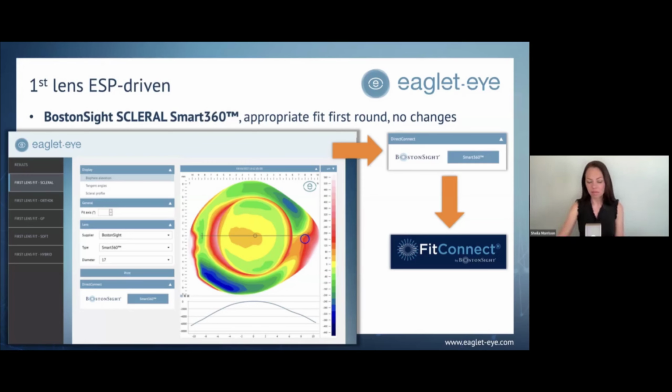When we measure a patient for HOA correction, before we get a lens that is called the HOA lens, we would get a best fit standard kind of single vision lens. So no multifocal optic in it. Could be toric, that's fine too, but the best distance correction that's possible for this patient. So that's what we got, best first lens.